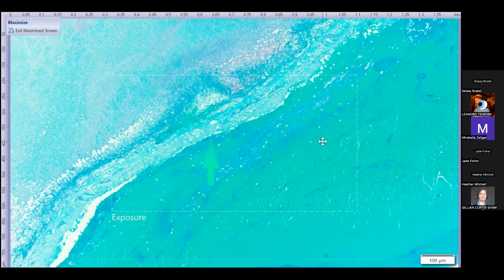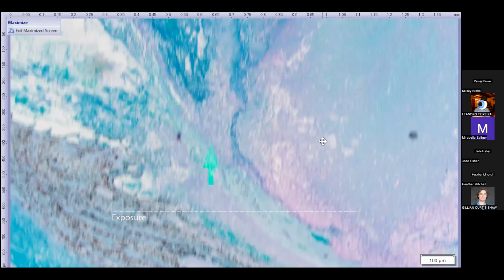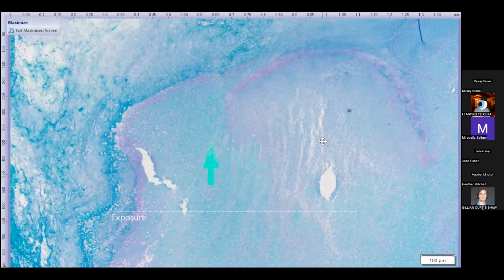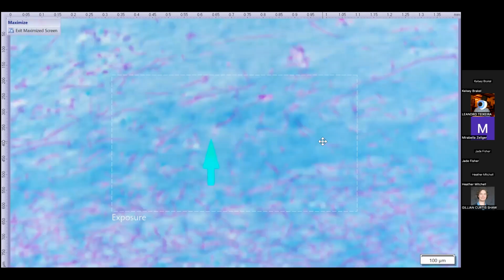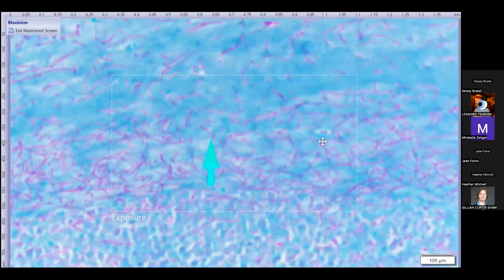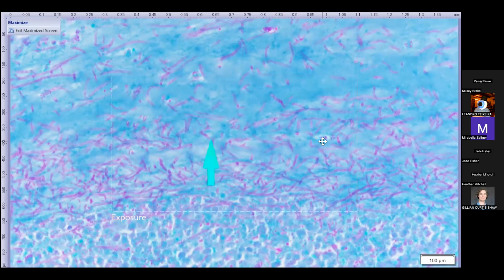Focusing on that same area. And PAS stains will make the fungal hyphae pink. And then fibrin does not stain pink. So what we see here are all those myriad fungal hyphae. Tons and tons and tons of them. I couldn't find really convincing septations, so they look pretty aseptate to me. They have parallel walls. I think they range from maybe 4 to 6 micrometers in diameter.